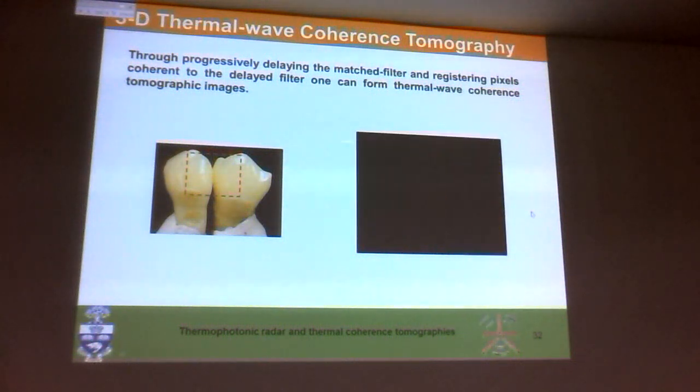So finally you can get other absorptions and you're done. But you really want to home in to see that signal from the caries, how that is generated. Because bacteria basically get in between the teeth and they stay there, and eventually they shed their proteins into the enamel, and that's how you start the rot of the tooth. So the enamel now decays, and the interesting thing is this method could also be called an amplification method, because it amplifies. You have the thermal component amplifying the optical component, because the optical absorption coefficient changes.